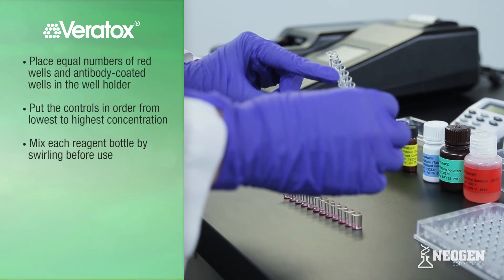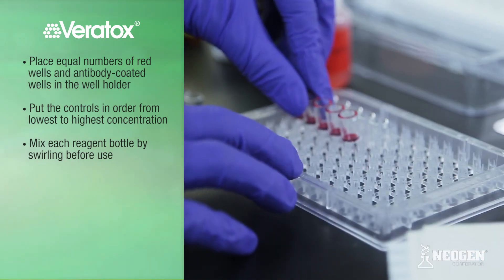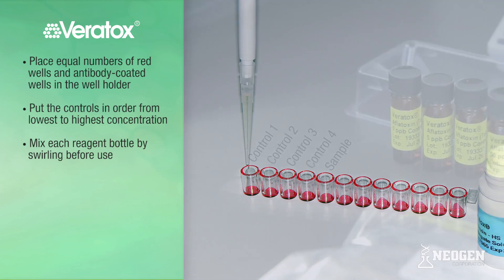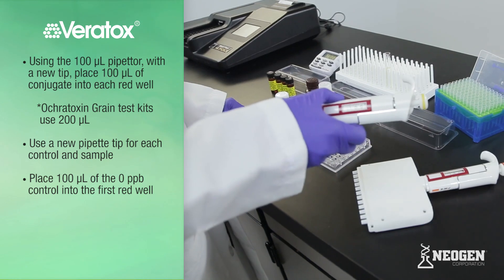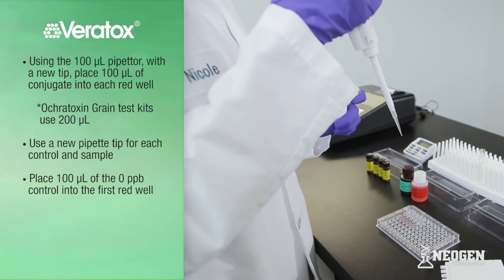To set up your test, place equal numbers of red mixing wells and clear antibody-coated wells in the well holder. You will need one well for each control and an additional well for each sample. For our demonstration, we will test one sample on the Veritox for Aflatoxin test kit, requiring a total of five wells — one for each of the four controls and one for our sample. Put the controls in order from lowest to highest concentration. Reagent bottles should be mixed by swirling each bottle prior to use. Using the 100 microliter pipetter and a new tip, prime and pipette 100 microliters of conjugate into each red well.